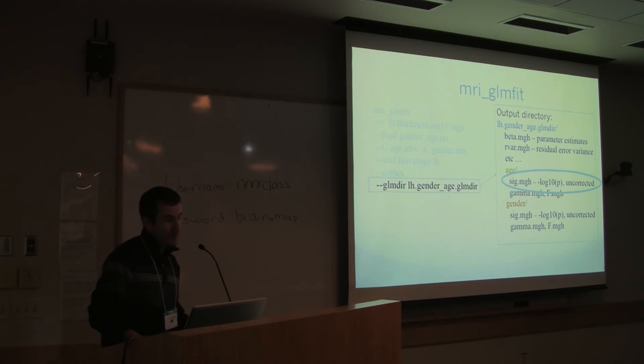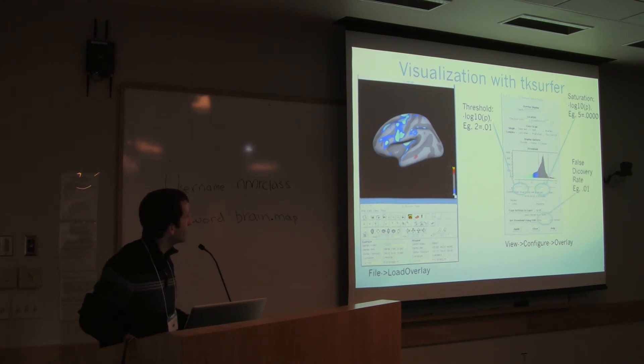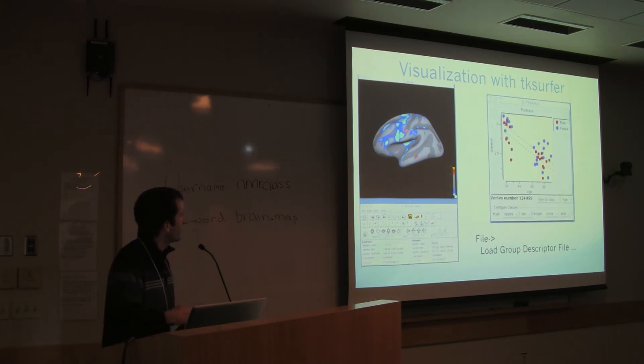So we can visualize these guys with TK Surfer or Freeview. You can also do it with QDEC afterwards, as we'll see. But you can generate this pretty map that we were talking about. Actually, if you load the FSGD file, you can also get the demographics. And you can actually click on the surface and see the distribution of your subjects at that particular vertex, of the thickness at that particular vertex.